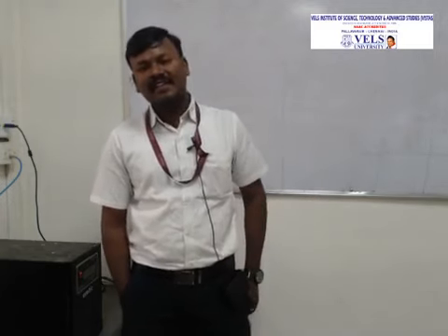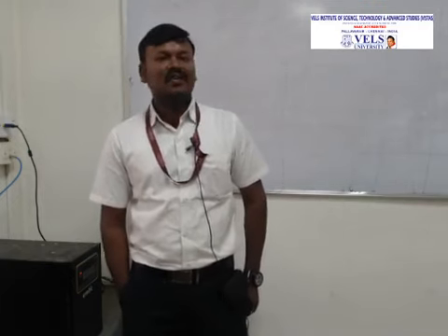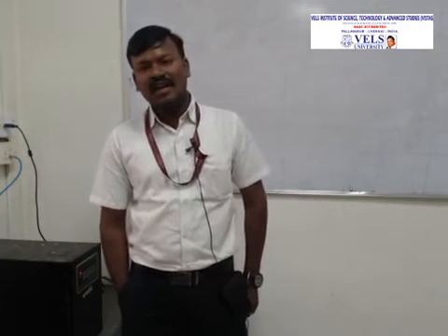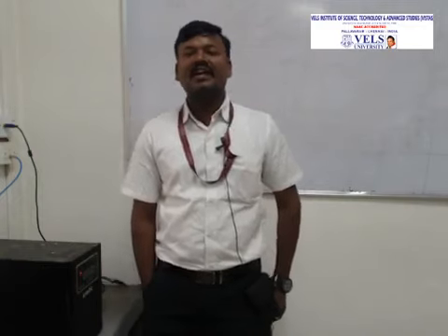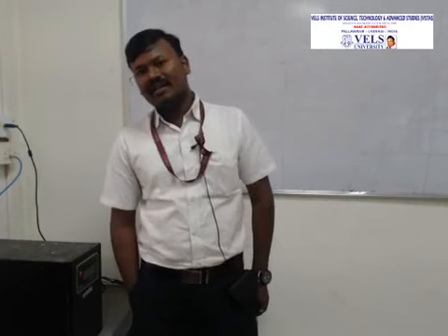In skilled hands, this generally does not harm the developing embryo. Each cell is called a blastomere. If you see this slide, you will understand what PGD is. The blastomere is removed from the 6 to 8 cell embryo, using a fine glass needle to collect the cell without disturbing the other cells of the embryo.